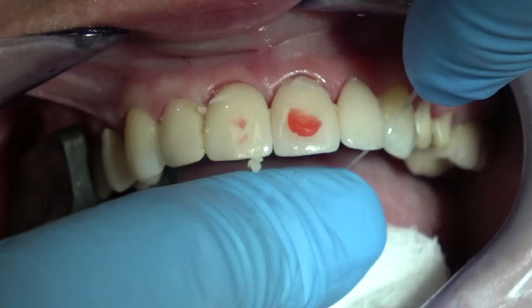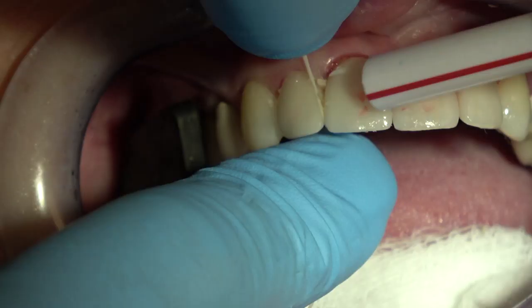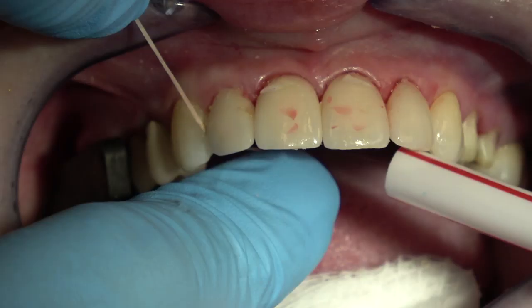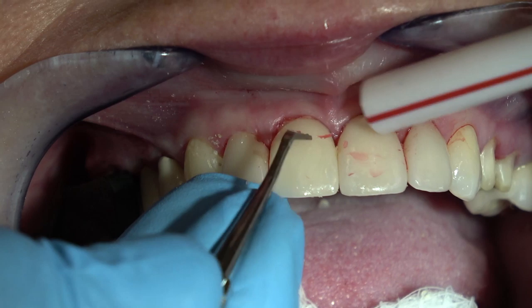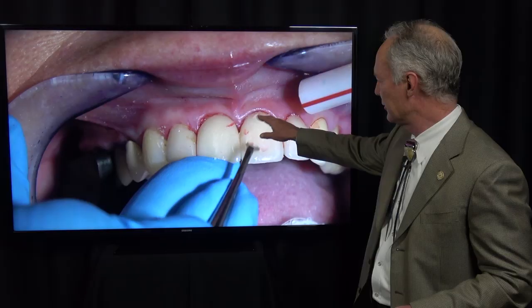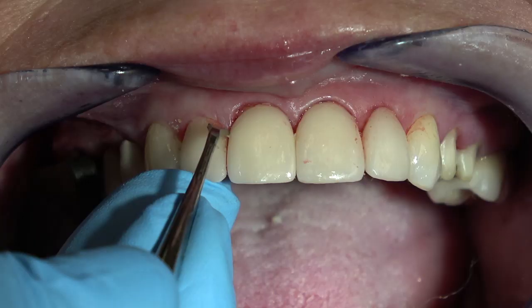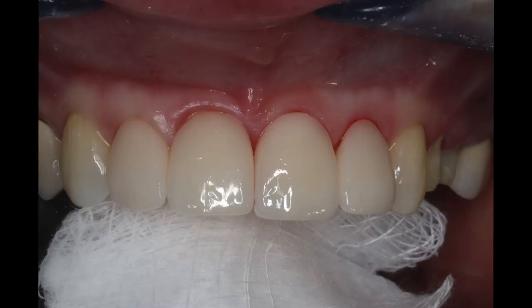It'll be perfect. Then you use wax floss and pop it between the teeth. Don't go crazy now because you haven't completely cured it. You've just got them set, with that 1 second cure on the palatal and 1 second cure on the facial. Then this is the square end of an amalgam carver. You're going to use that to remove any luting composite or adhesive from the facial surface of the veneers. It's very effective for that.